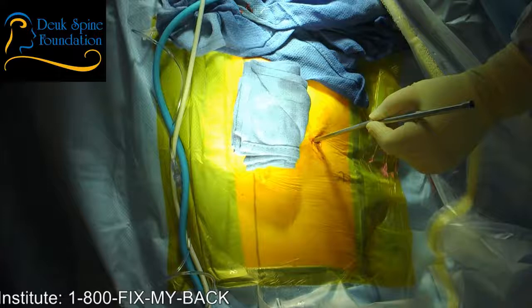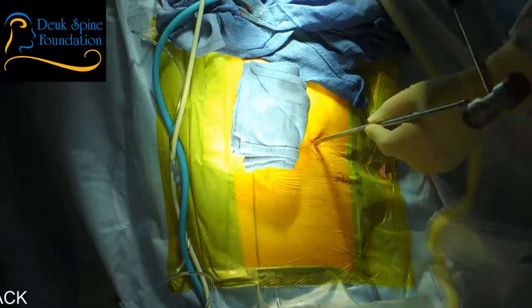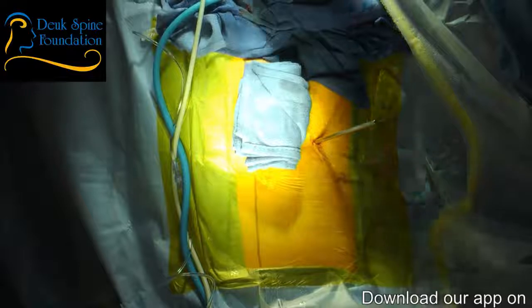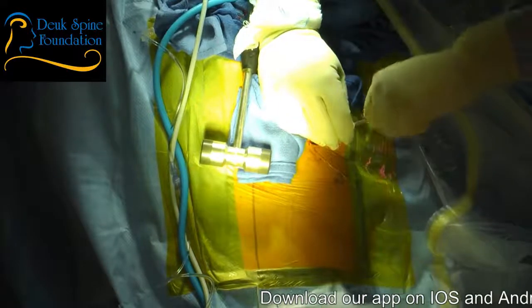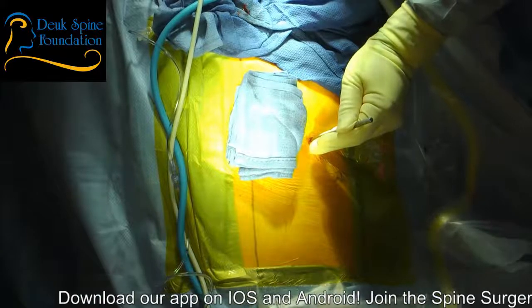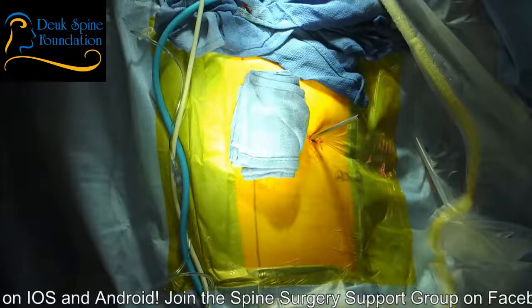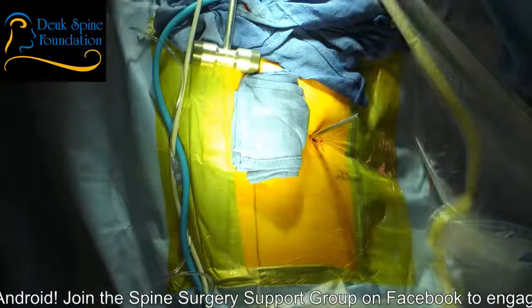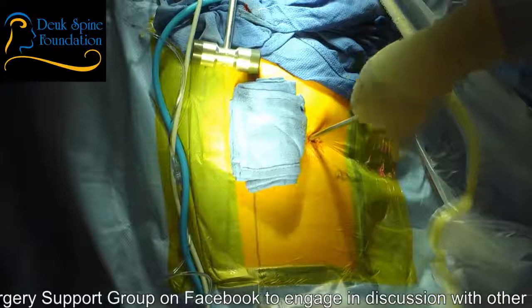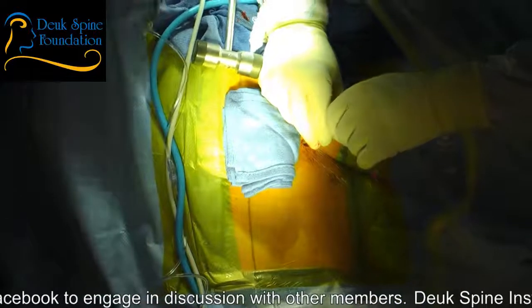So once again, I'm using the mallet to gently advance the dilator tip through the foramen into the herniation. And I have a feeling this disc is going to be more reactive for her. Don't you think? Because we know it's more painful. I think I'm in a position I could take the guide wire out right here. The reason you want to get the guide wire out at some point is otherwise you'll trap it with the tip. You got metal to metal. And the problem is that the tip of the dilator will literally bend the guide wire and pinch it. And then you won't be able to get the guide wire out. Then you have the risk of breaking the guide wire in the disc space, which is not something you really want to do, period. I mean, it's bad. Then you have to do an open surgery to get it out if you want to get it out.